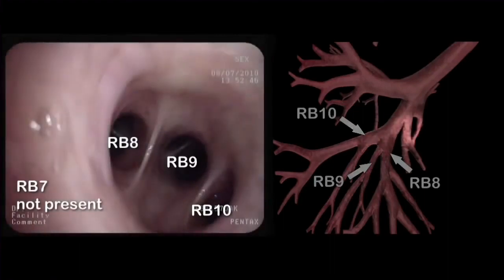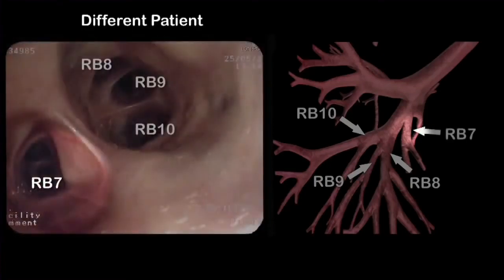In most cases, the medial basal branch or RB7 can be found at the medial side of the lower lobe bronchus. In this patient, however, RB7 is absent. This picture from a different patient shows an example of the medial basal branch or RB7 of the lower lobe.